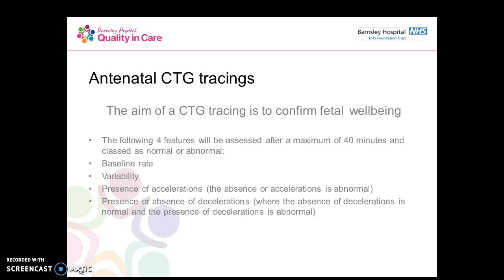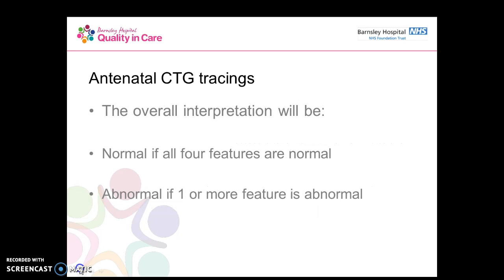When we're interpreting these CTGs, we need to assess them after a maximum of about 40 minutes or so, but obviously if there were really concerning features on them, then you'd get them assessed by a doctor before then. And we look at 4 parameters: baseline rate, variability, presence of accelerations, and presence or absence of decelerations.